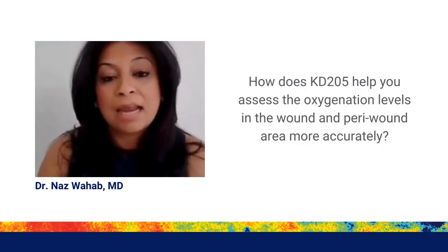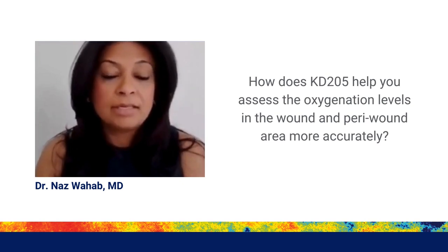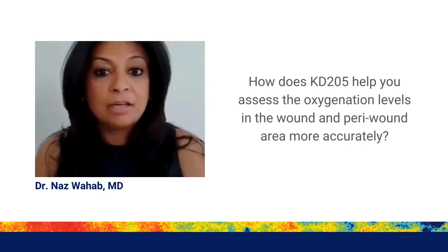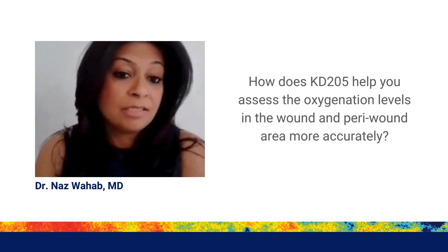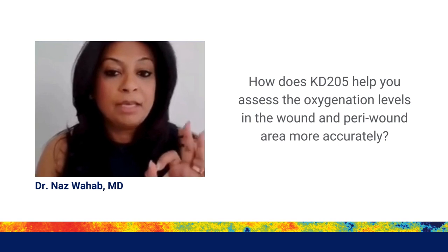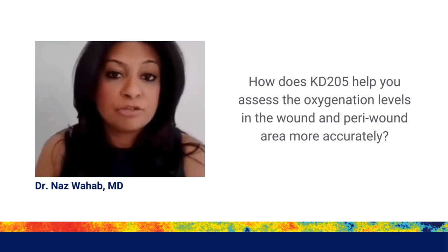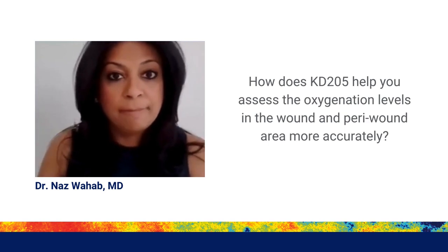I was not able to do that, and sometimes visualization of epithelium does not always appear so easily assessed, especially when you have healing on a darker complected individual, that skin may be lighter in comparison. And so when you're actually being able to compare the healed area and the peri-wound area, you can see it more. It's just a more striking visualization and able to make better assessments to where they are in the wound healing continuum.